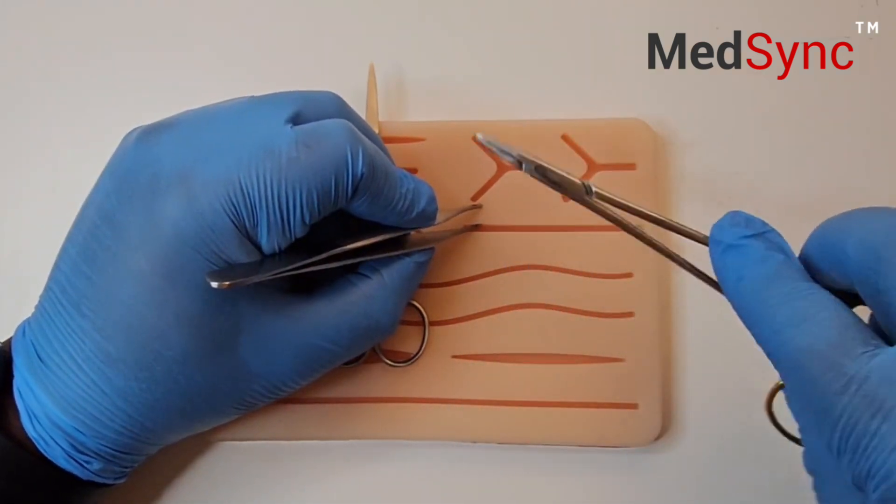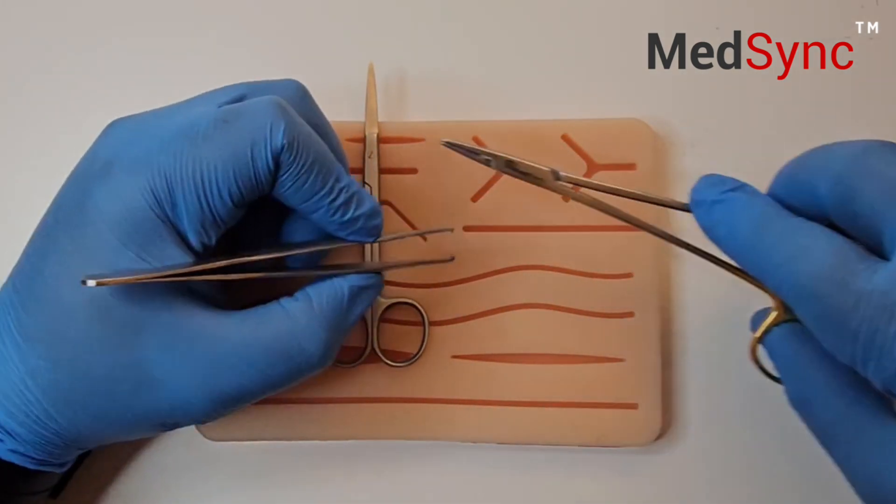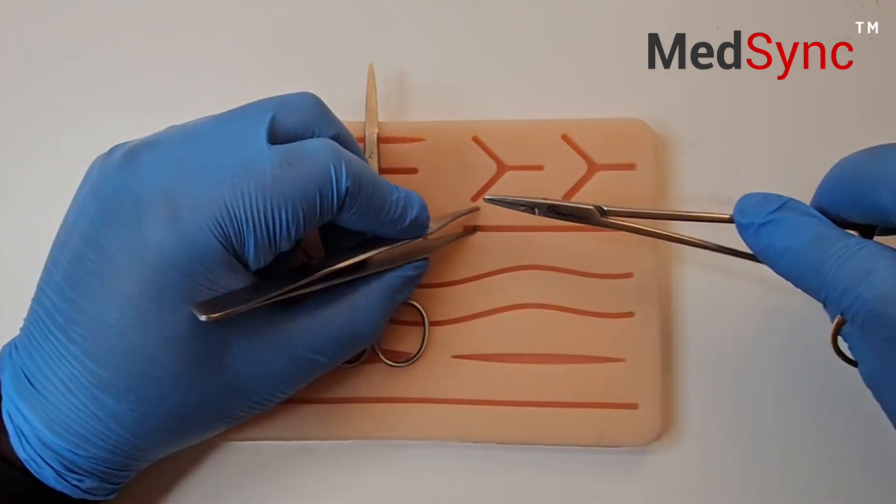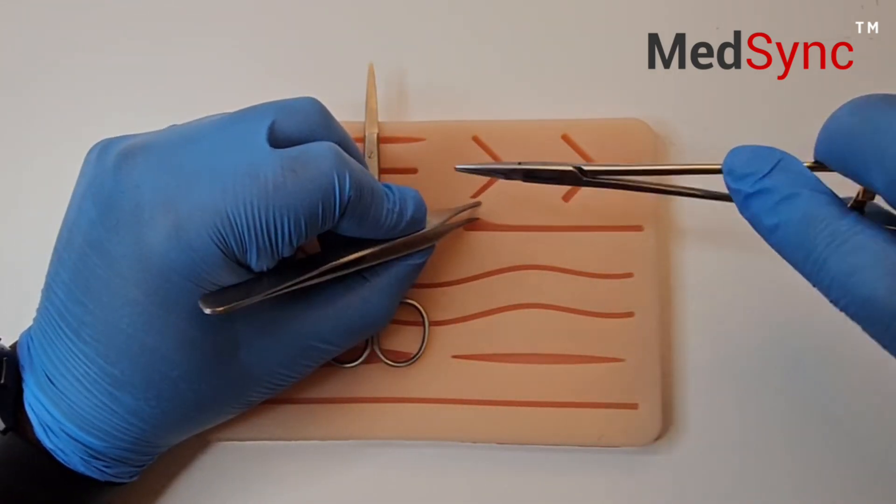You do this at the same time as holding the needle holder or the scissor in your dominant hand. Most instruments are right-handed instruments so it would typically look like this.